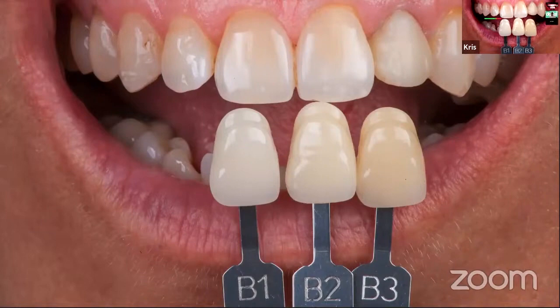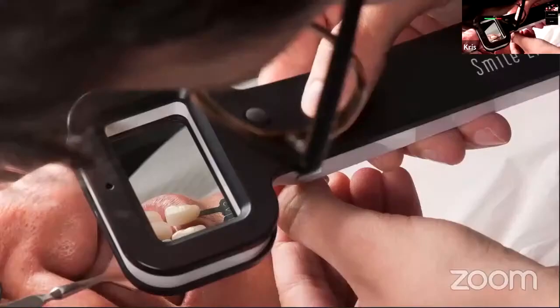And in dental photography, especially, it's critical when we send the information with the color that we set up our light correctly. Because the worst light or worst type of flash which you can use for the color transfer is the ring flash. If you are using a ring flash, it is the worst type of photograph, because you can do nothing with this information. The reflection of the light is very, very big and you really have problems reading the information about the color from the tooth structure.